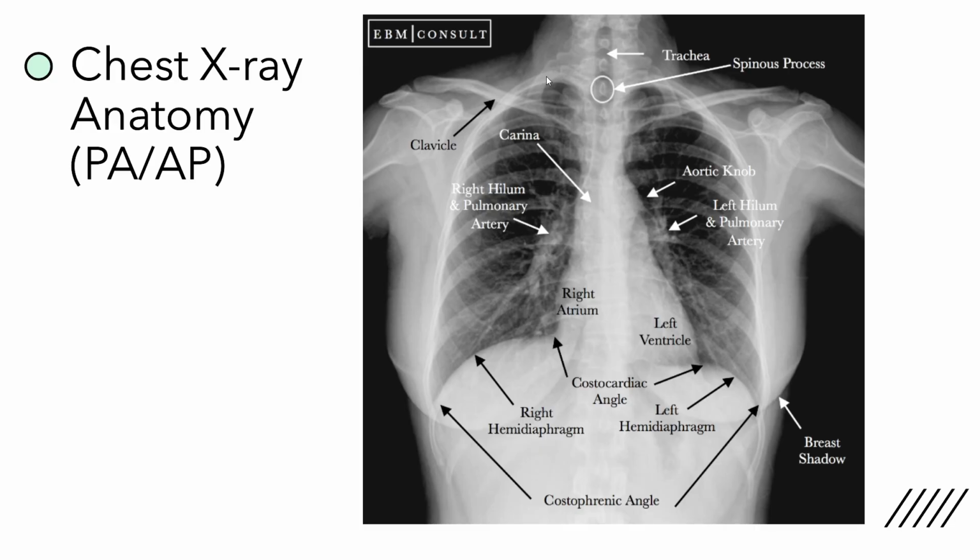It's important to count ribs when we're looking at x-rays because a really good x-ray of the chest is going to have 10 ribs visible. So we'll look at one side here and go 1, 2, 3, 4, 5, 6, 7, 8, 9, and then there's the 10th one. We can still see more ribs underneath the diaphragm, but 10 ribs visible in the lung field is really great. That means they took an adequate inspiratory effort. That means they took a nice deep breath in and held it, enough that we could see the amount of chest that we need to see.